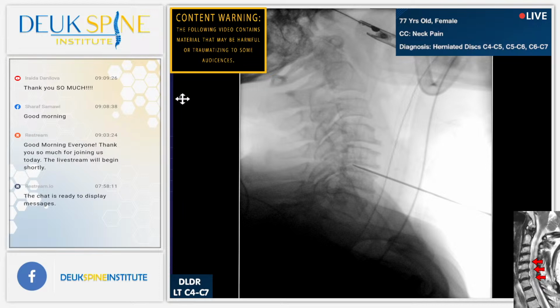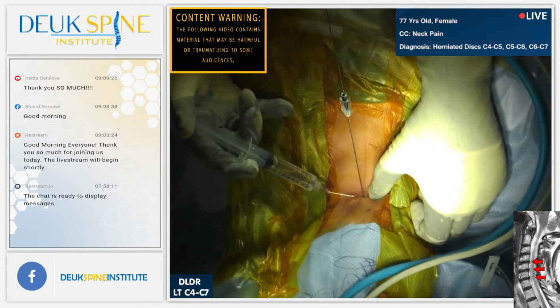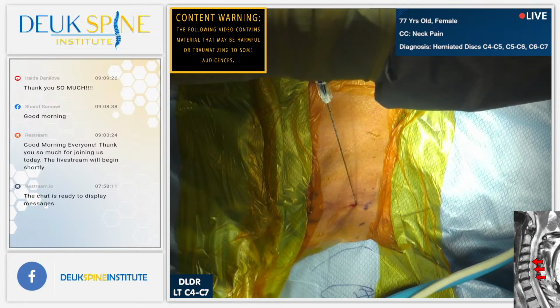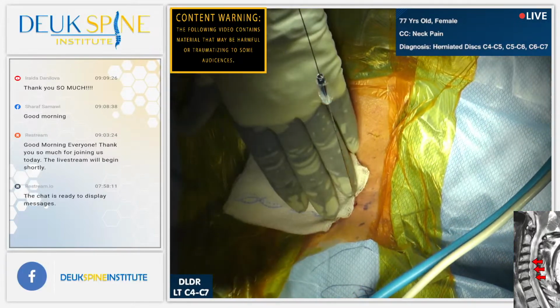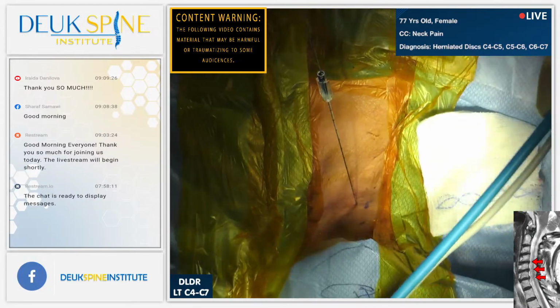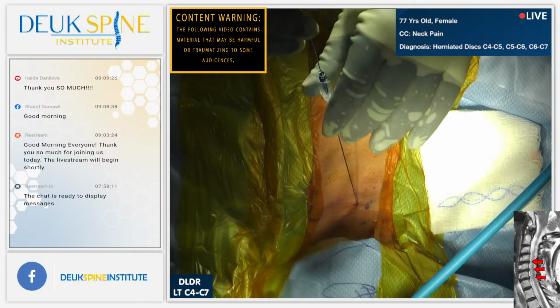Now we're going to numb up the skin and we're going to do our incision. We're going to use a little bit of lidocaine and marcaine. We don't use epinephrine anymore. We discovered that it's increasing the blood pressure a little bit. We want to avoid that. All right, well, let me know once they have an idea of how much of that pain, where the X is. Incision, 4 millimeter incision. Now I'm going to take out the needle shot.